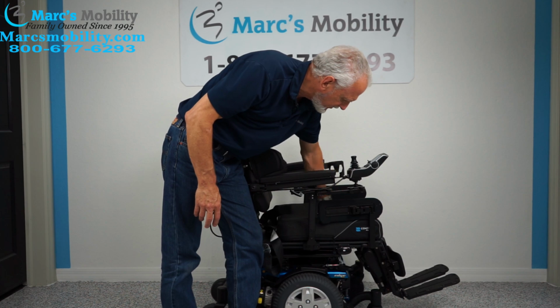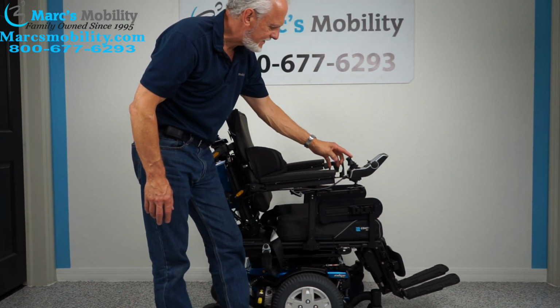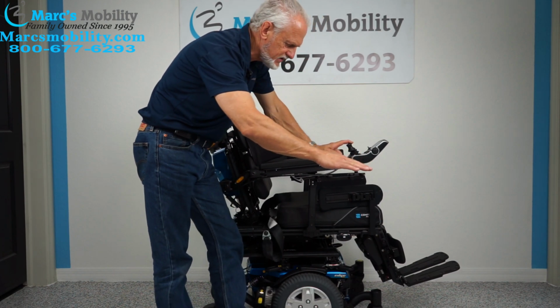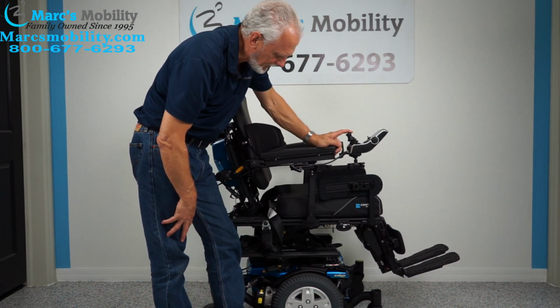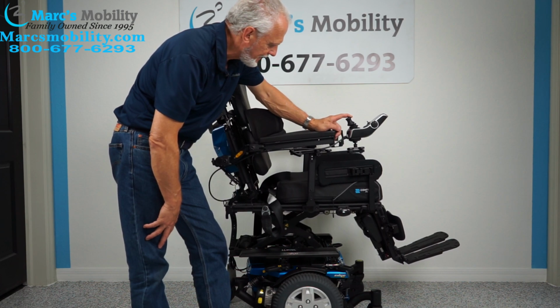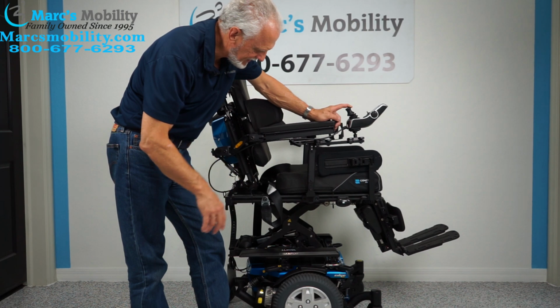So I'm going to try to get it just to yellow on the bottom. Yellow cushion right here, just on this cushion right here. That's the seat lift. So if I pull the joystick back, your seat's going to start going up, okay? So by the time you're all the way up, and the chair will still drive with the seat elevated.